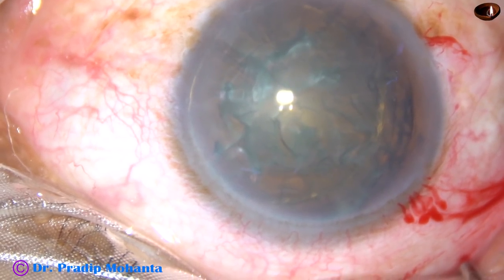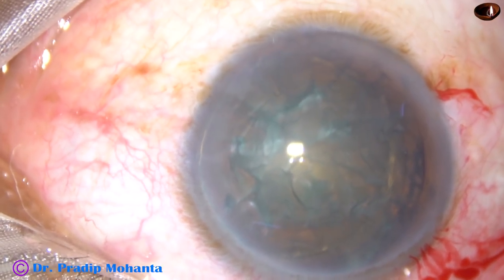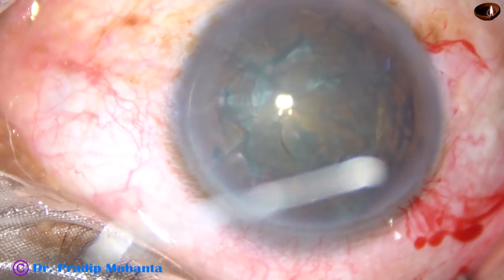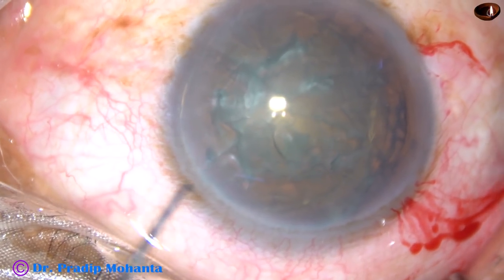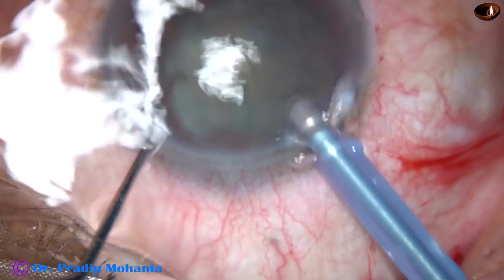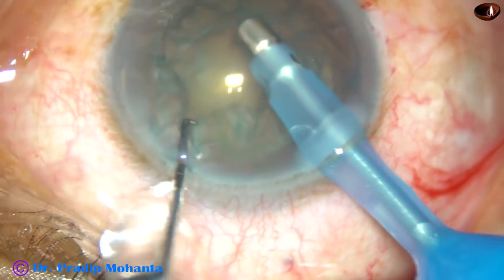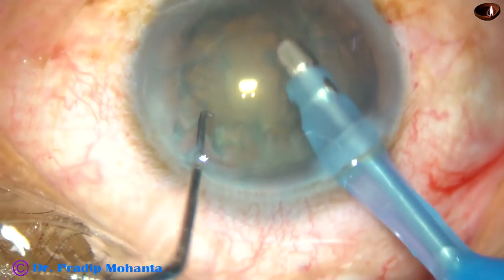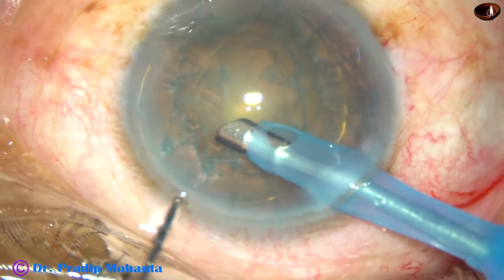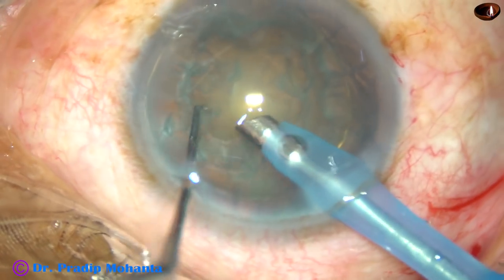And now let us see how the carousel technique is done. The tip of the phaco handpiece is introduced. The bevel is kept sideways towards the mass. It is at the junction of the epinucleus and nucleus. First, remove some superficial cortical matter, and then go at the edge of the nucleus, face the nucleus, and apply vacuum and energy.